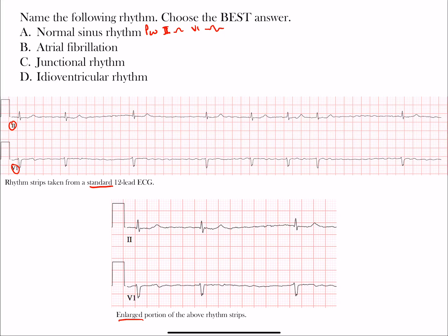We'd also want to see similar morphology in those P waves. However, looking throughout the strip, there are no P waves present — no clear P waves in either lead II or V1. The absence of P waves tells us we are not dealing with a sinus rhythm, so choice A is ruled out.